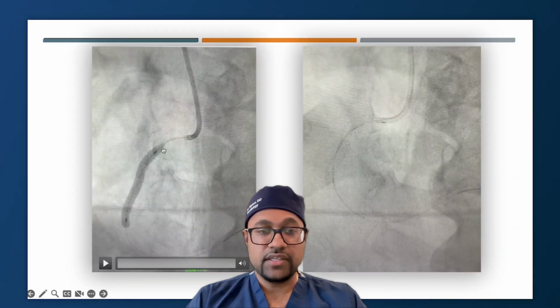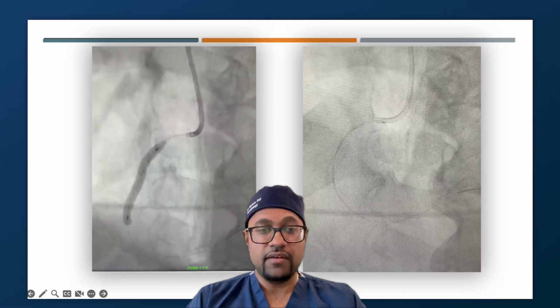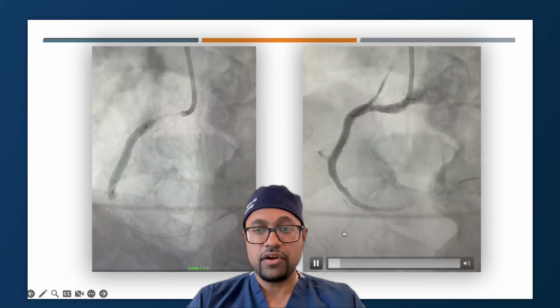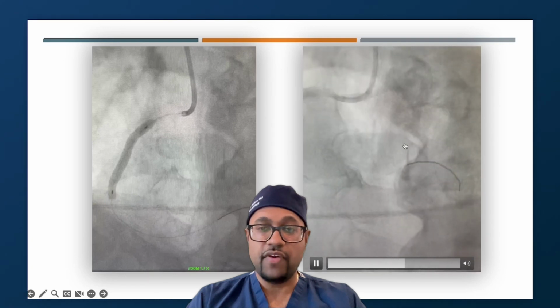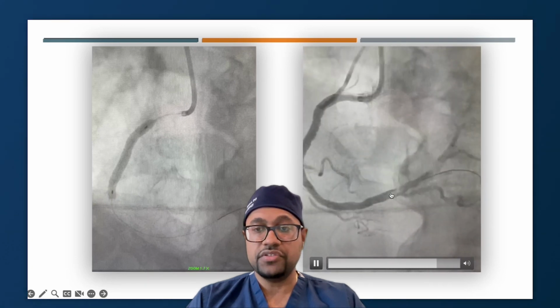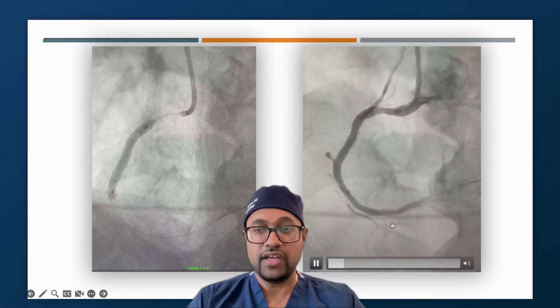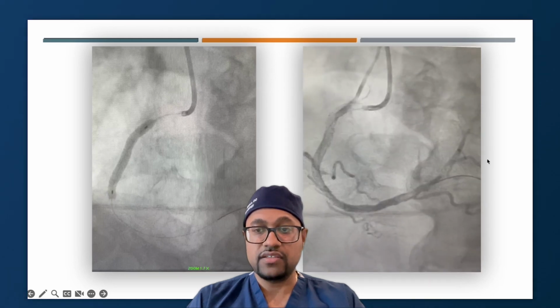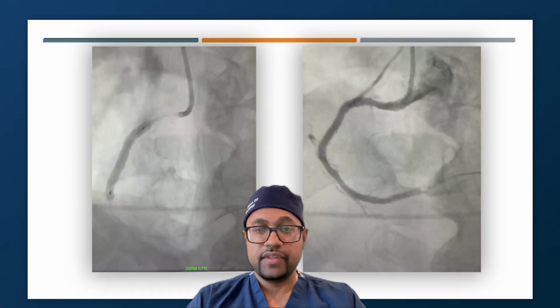So I decided I needed to get the patient stable. The first thing I do is stent that proximal vessel where the original plaque rupture occurred. Now I have nice TIMI 3 flow, or very brisk flow through the RCA, but I still have that large filling defect in the distal part of the vessel. So that's my next plan: how do I deal with that?